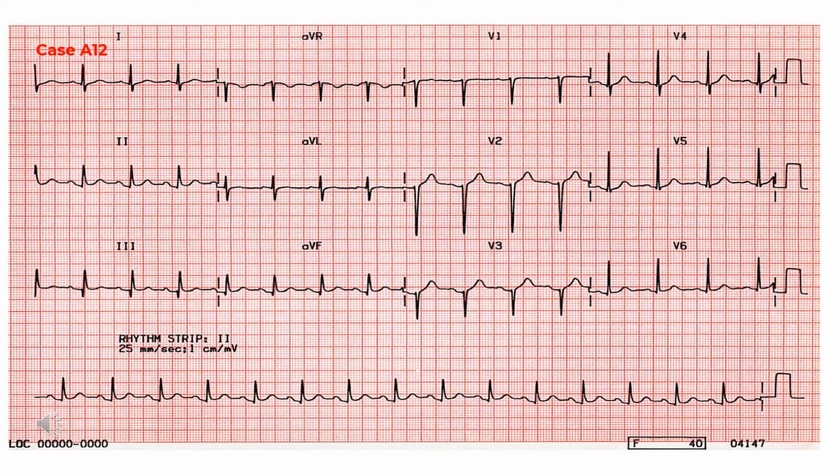Comment. The ECG does not provide definite evidence of previous infarction, the only clue to possible infarction being the pattern of R wave progression in the precordial leads. The ECG could be said to be compatible with old infarction, although not diagnostic.